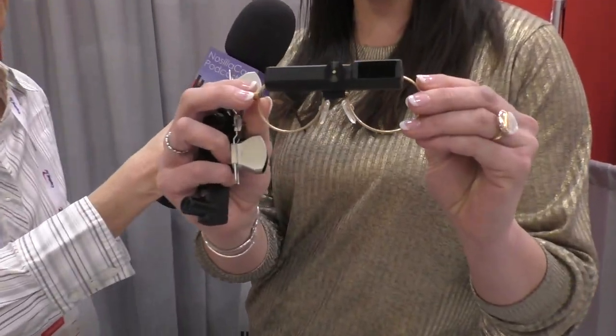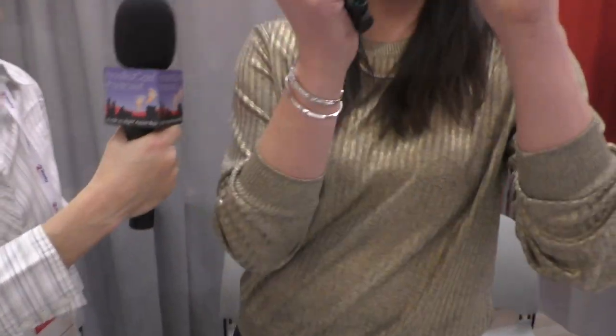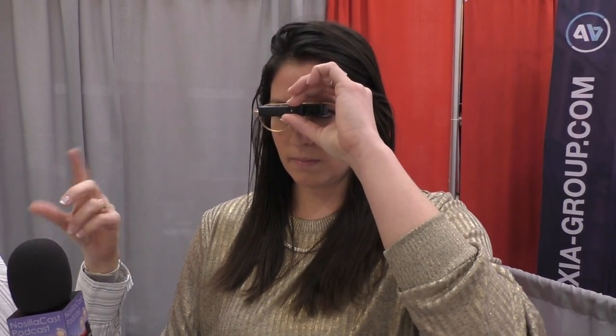That one she's got is monocular, and it will attach to the top of your glasses. You look through the carrier lens normally, and then when you want to see something at a distance you tilt your head down. So it's exactly the opposite of the way you would use bifocals — it's sitting above your line of vision. There's a tiny little focusing dial on the front of it; it's really easy to grab and focus. I was able to see distance quite easily with that.